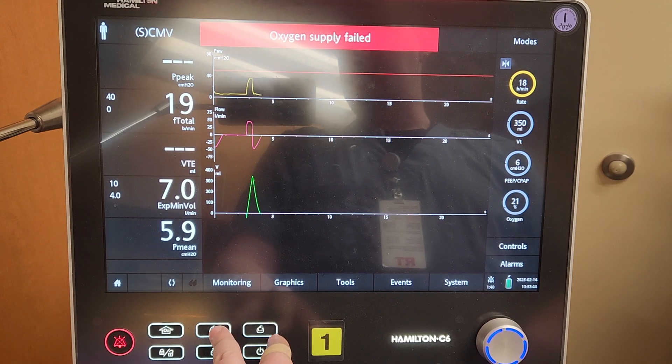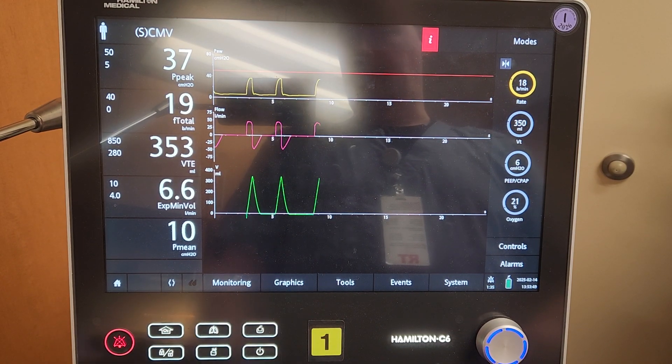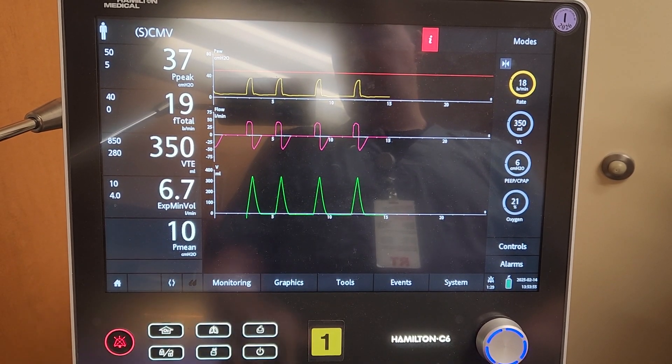Here we have a manual breath button — if you accidentally press that, it's just going to give a manual breath and won't actually harm the patient. This is a print screen button; it doesn't physically do anything because there is nothing plugged into the ventilator.